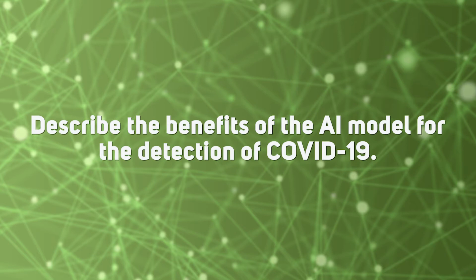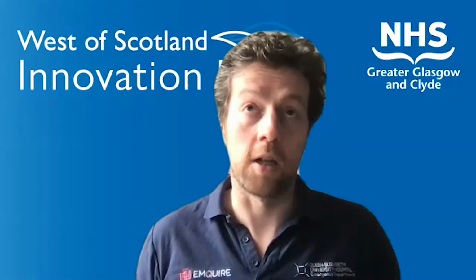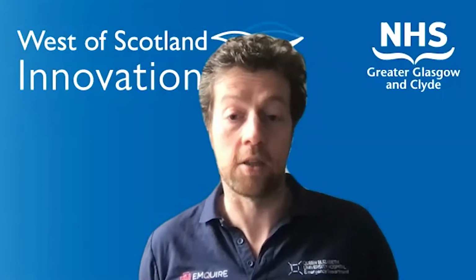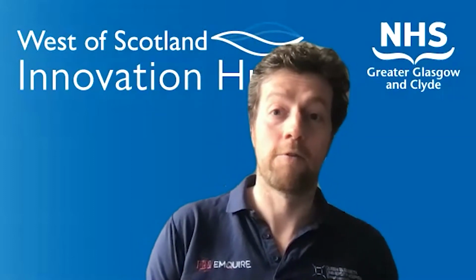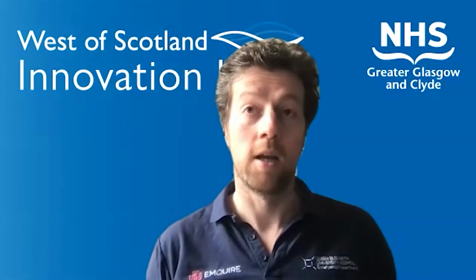So we're still at feasibility stage for the project. So the next stage is for it to be integrated within clinical workflow and to examine that. And there are really two options. One is around triage support for the radiologists, to be able to surface to them those that are likely to be COVID presentation x-rays, and therefore for them to put that into the report. But equally, we're very much looking at how we can embed that into the frontline requesting piece, so in the emergency department or a respiratory ward, and support clinicians by just flagging those individuals that potentially have COVID.